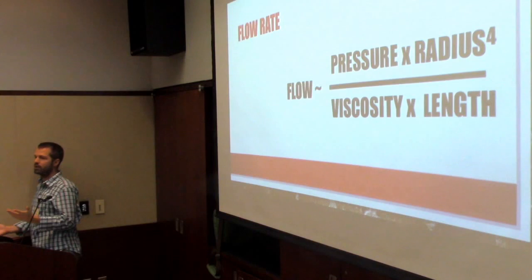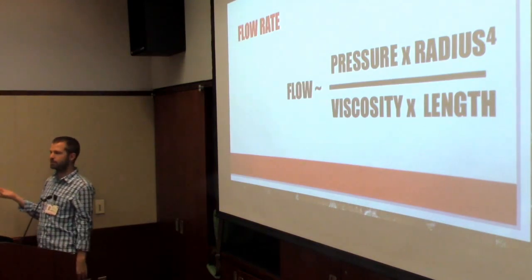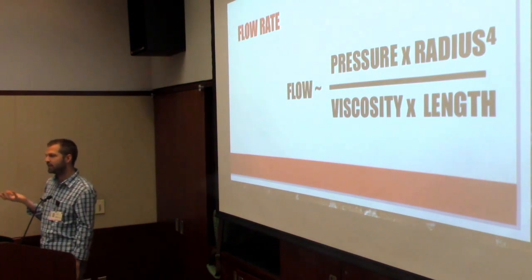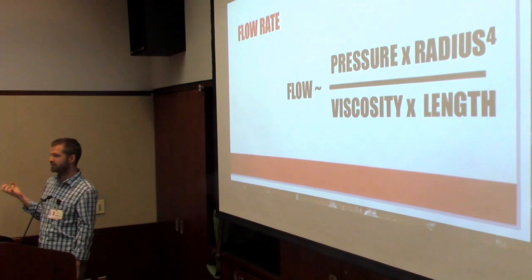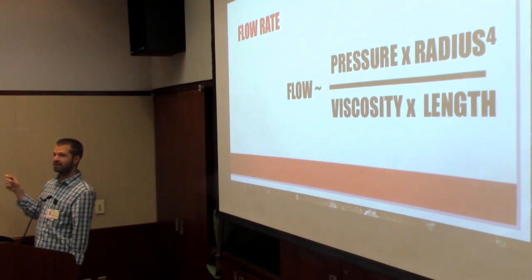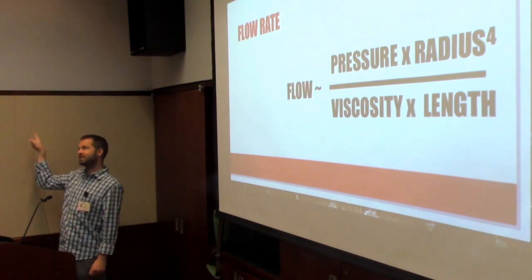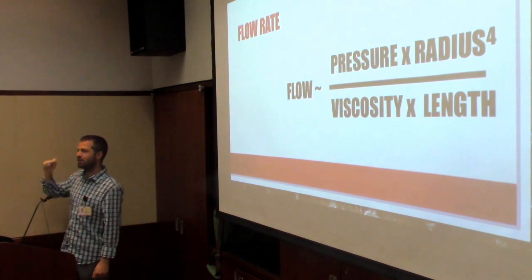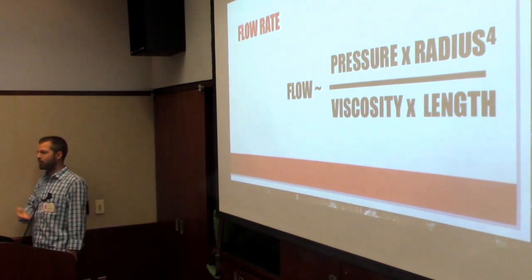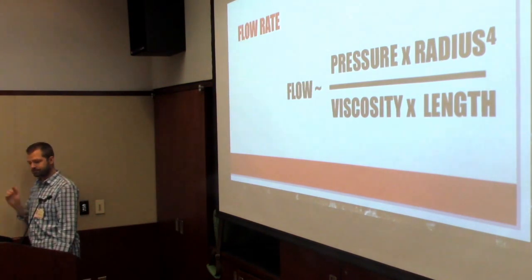How are some ways we adjust the pressure? We've got a bag of IV fluid. Pressure bag. Anything cheaper than that? I could squeeze it. Anything even cheaper than that? That's manual labor. Hang it. If anyone's ever seen me in the Columbia ED, I'm on my tippy toes, like clawing at the hooks above the thing. I have no patience at all, so I'll hang all my IV bags on like the roof hooks and just dump water into people. So getting it high up, getting the pressure up, these are all great.